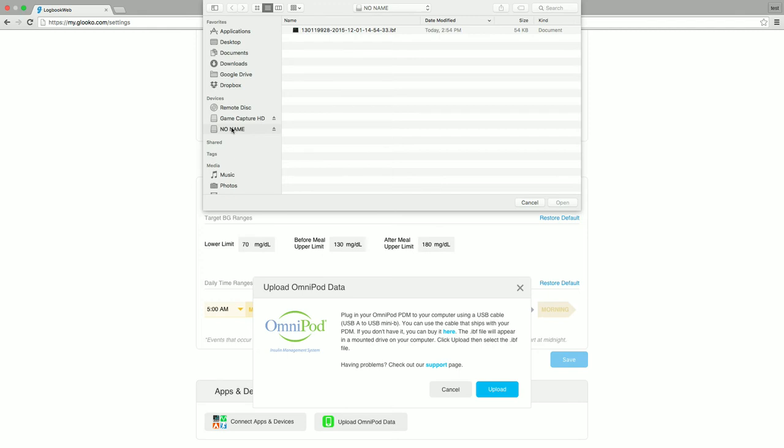Find and highlight the file that ends in .ibf. Once it's highlighted, click open.